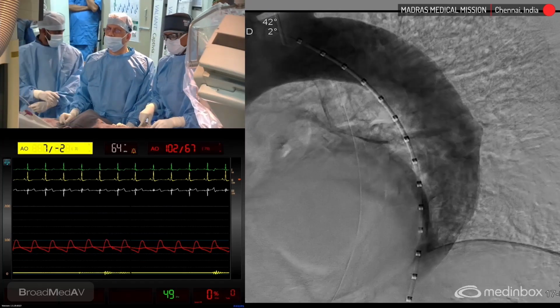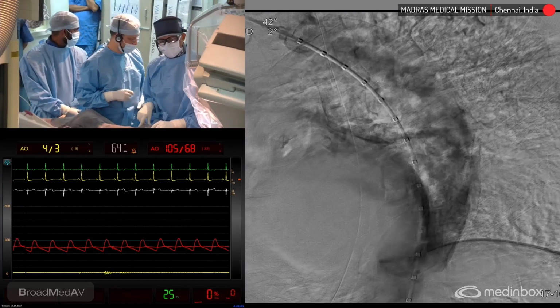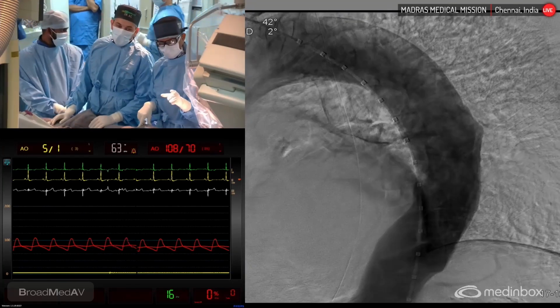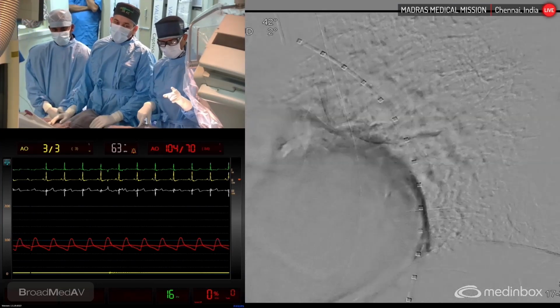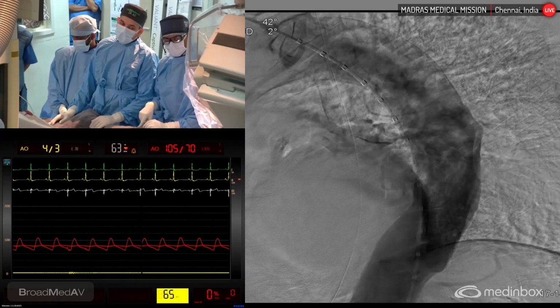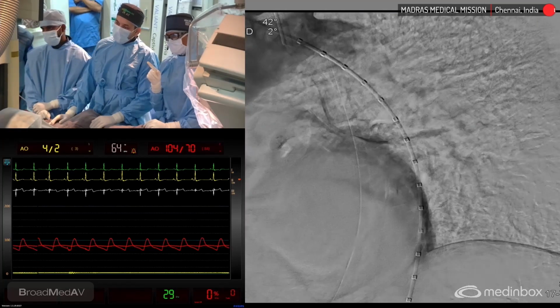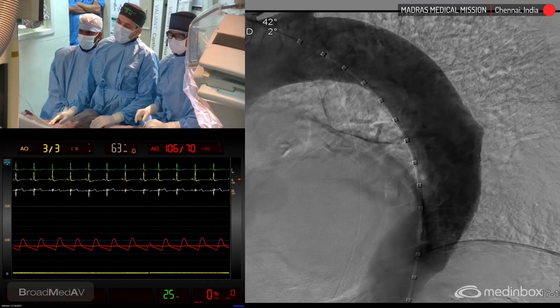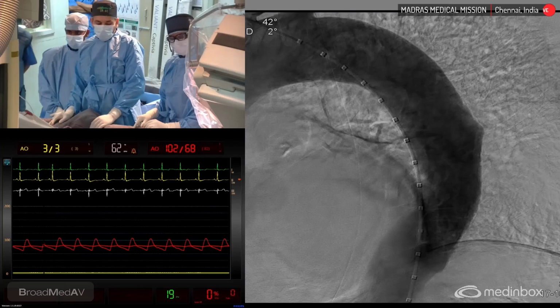And in the CT, can you put that CT image previously? Yeah, if you see, even in this image of the CT, the luminogram did not show any aneurysm. We can see a thrombosed aneurysm on the right side of the image where the arrow mark is seen, because the contrast is not entering the aneurysm. So we couldn't see, but we can see a small pouch projecting on the major curvature. This is the place of the aneurysm. So the aneurysm will be projecting like this.